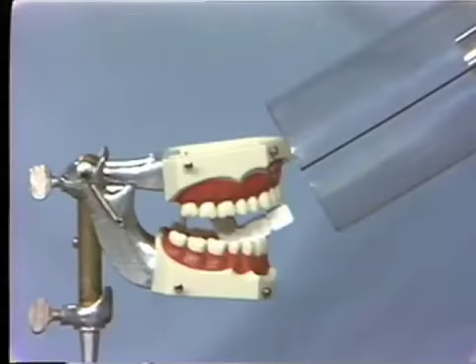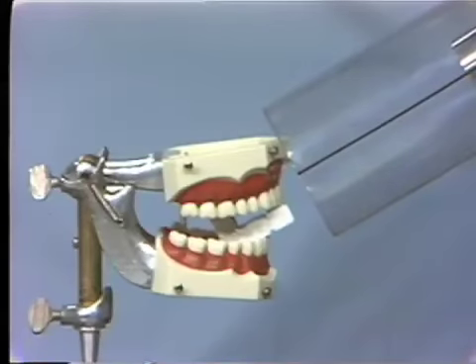There we have directed the center of the beam at the center of the film. Now, we're not able to see the center of the film due to the presence of the teeth and so on. So in actual practice, to achieve this degree of centering, we direct the central ray at the gum line of the teeth. There you see the black line on the cone is aimed at the gum line of the teeth, and the central ray, when projected, would hit about at the center of the film. Then the last step is simply to expose the film. So this constitutes the series of 5 steps used in making the periapical survey.